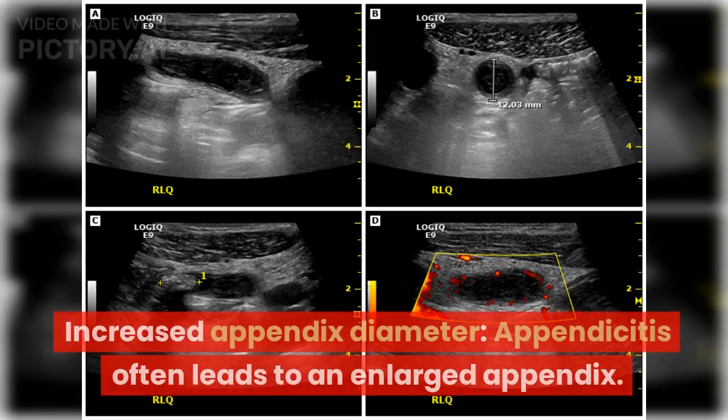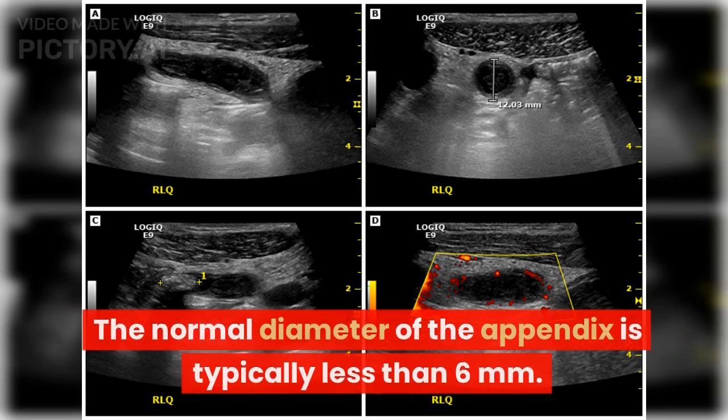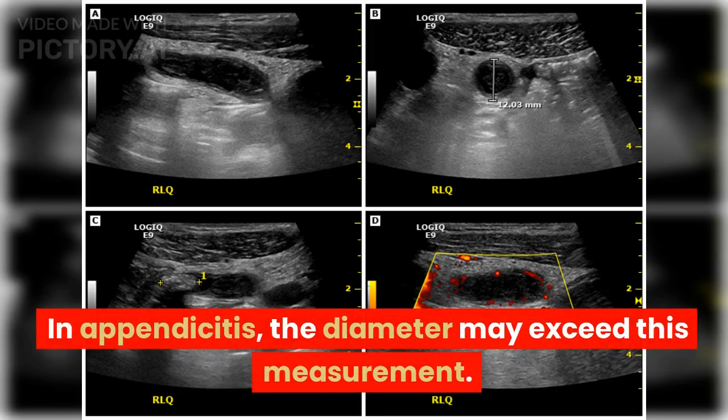Increased appendix diameter. Appendicitis often leads to an enlarged appendix. The normal diameter of the appendix is typically less than 6 mm. In appendicitis, the diameter may exceed this measurement.